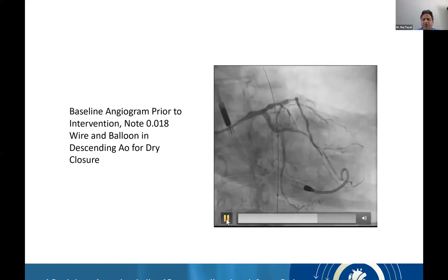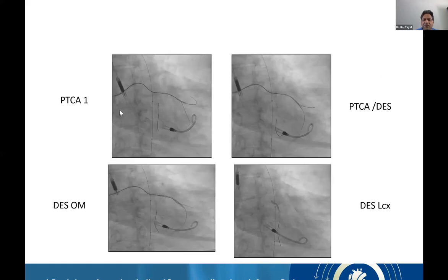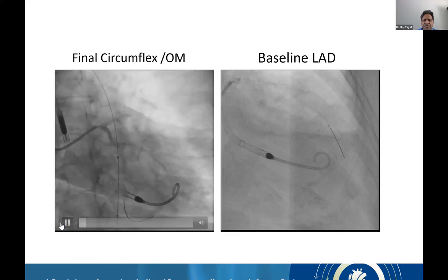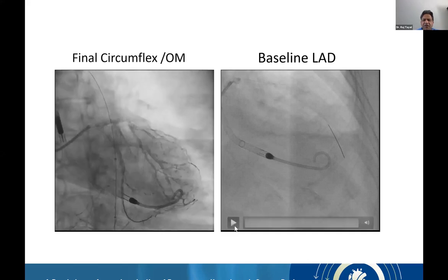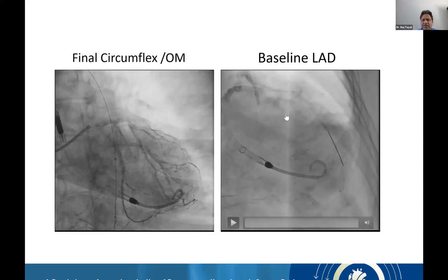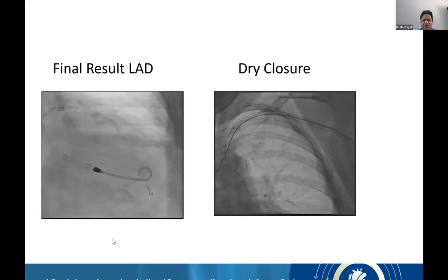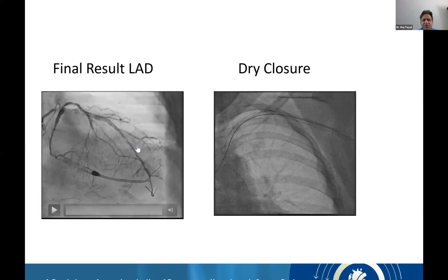And then proceeded with our coronary intervention, beginning with the left coronary circulation. We went ahead and performed a DK crush of the circumflex, as you can see here, with a reasonable angiographic result. And we did do a CSI atherectomy of the LAD, given its calcified nature, after intravascular ultrasound assessment, and put one long stent. You can see with a reasonable result there.